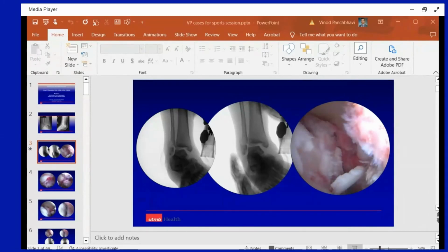And then, like we've seen Professor Rammelt also do this hook test. It only shows lateral displacement, does not show anterior posterior displacement. But the point is that we can actually use our ankle arthroscopy to diagnose what is actually holding the reduction back. At that stage, I actually started opening the medial side, and a deltoid ligament was ruptured. So we put suture anchors and wanted to make sure that it will not displace in the postoperative healing period.